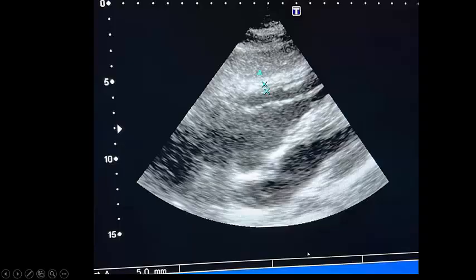Also, you need to check the wall of the right ventricle in a patient with acute cor pulmonale to confirm it is acute, because in chronic cases the wall will be thick, but in our patient the wall is 5 millimeters, which is normal. So our patient has a classic picture of acute pulmonary embolism with acute cor pulmonale: thin, dilated right ventricle, positive 60-60 sign, and it is straightforward, with hypotension and hypoxia. Really, it is a full meal of acute pulmonary embolism.